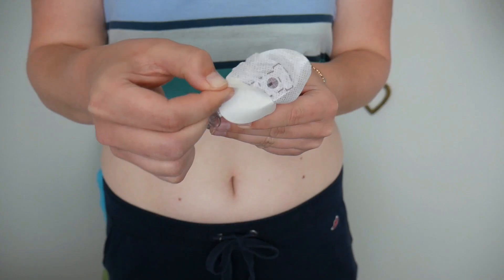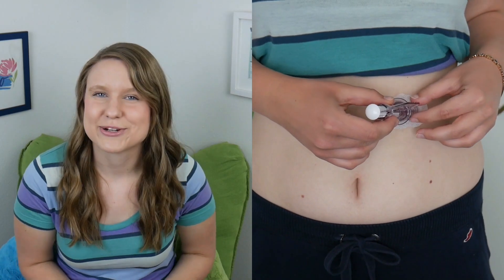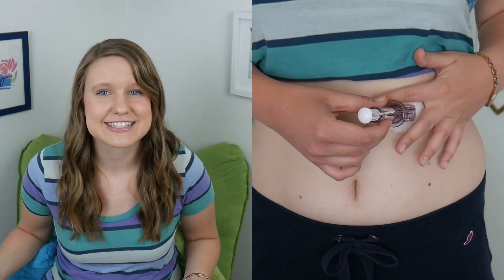Grab your sensor applicator and remove the two adhesive backings. Place horizontally on your body and make sure you smooth out the adhesive so that it sticks.